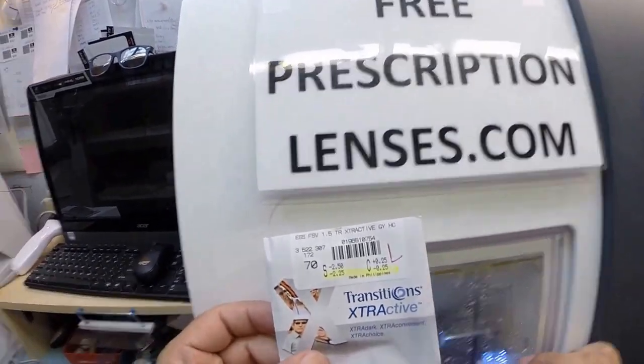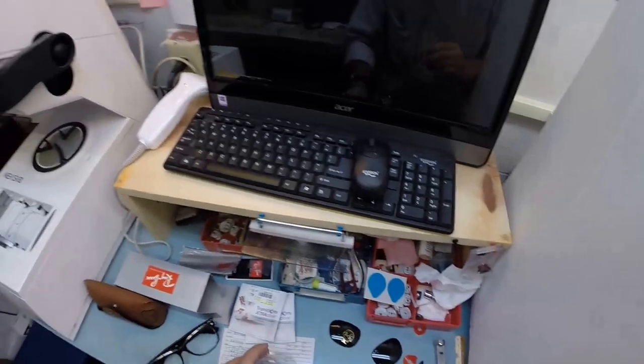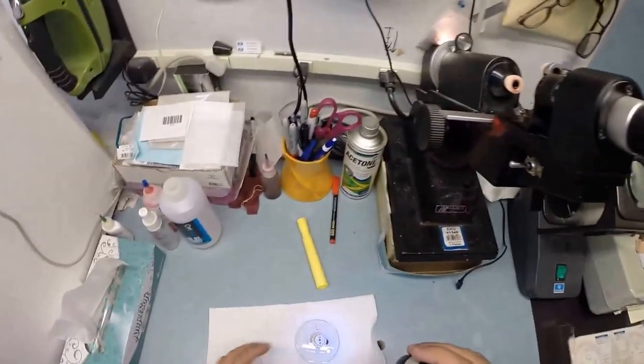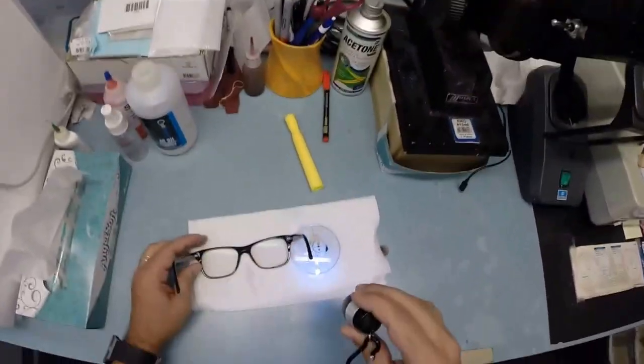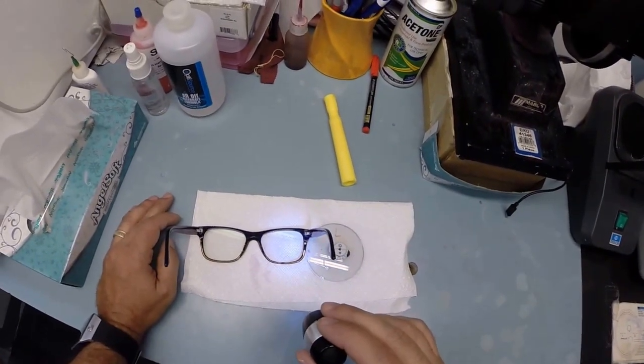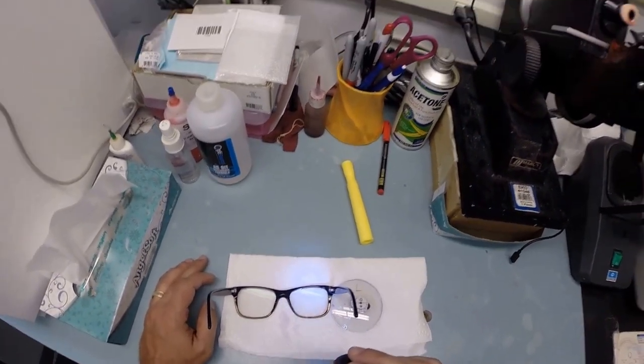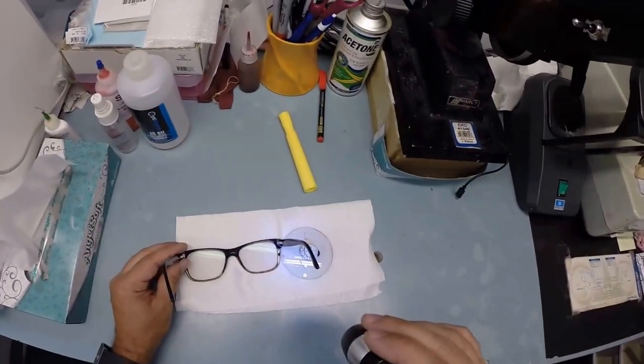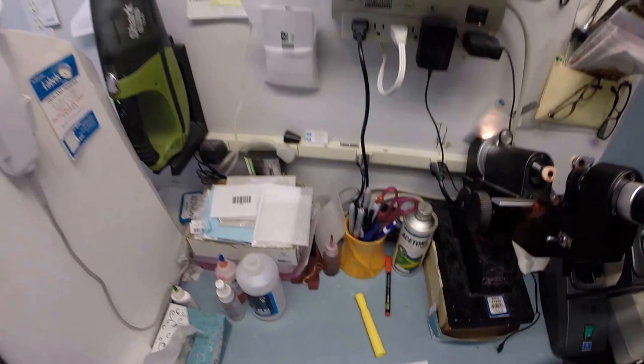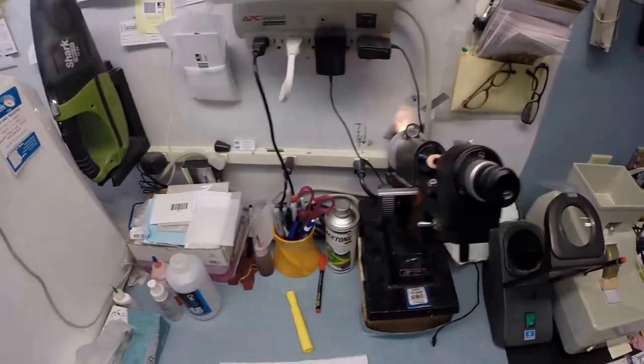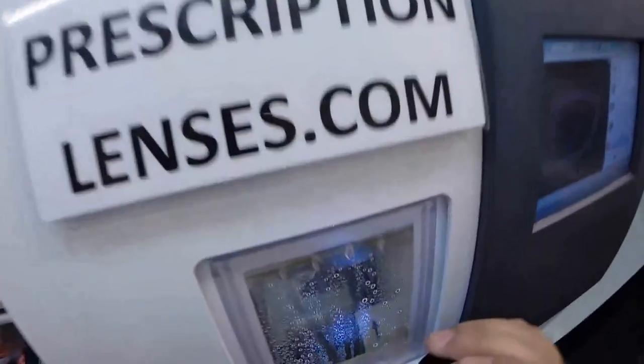Now the transitions extra active is designed for extra active people who want it that much darker. It still has a little bit of a residual color inside. Let me get a piece of white paper. I'm gonna place my lens next to it. You can see how it has a little bit of a gray tint even indoors compared to my regular transition lenses in my frame. It has like about what I would call a 10% gray number one solid tint even indoors, but it's gonna get very dark outdoors.